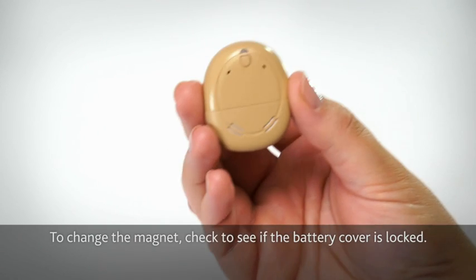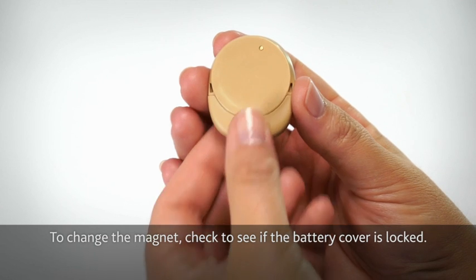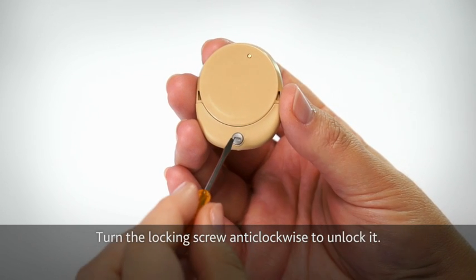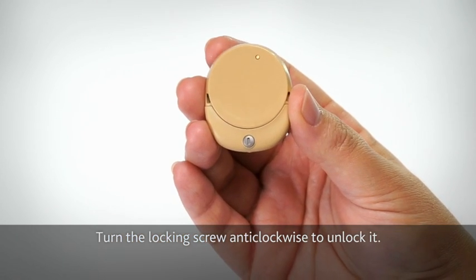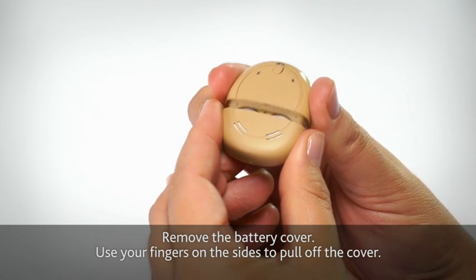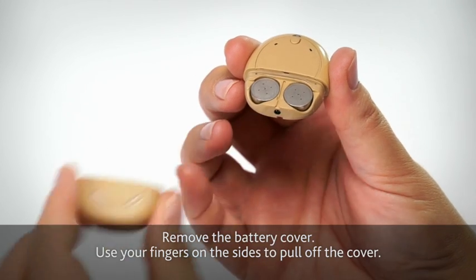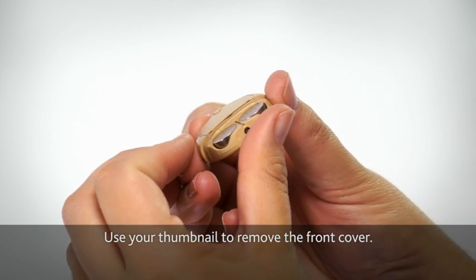To change the magnet, check to see if the battery cover is locked. Turn the locking screw anti-clockwise to unlock it. Remove the battery cover, using your fingers on the sides to pull off the cover. Use your thumbnail to remove the front cover.